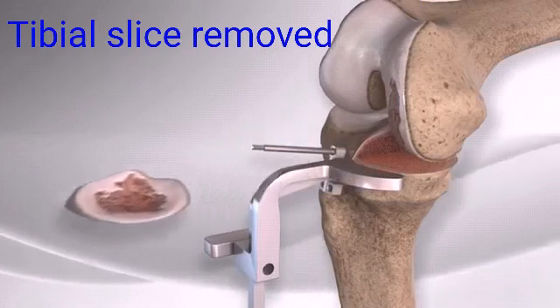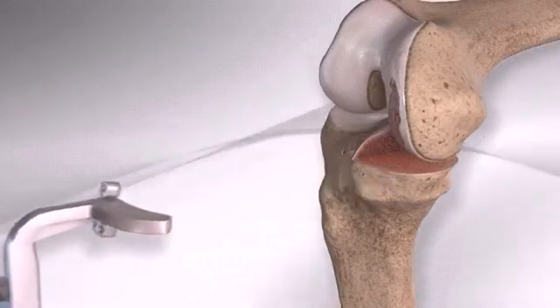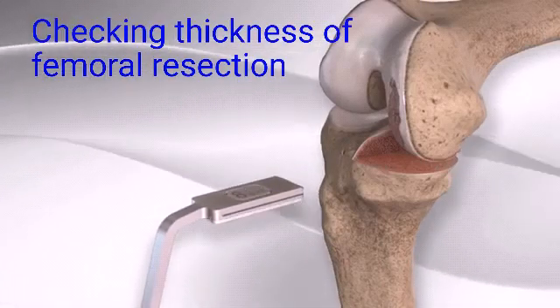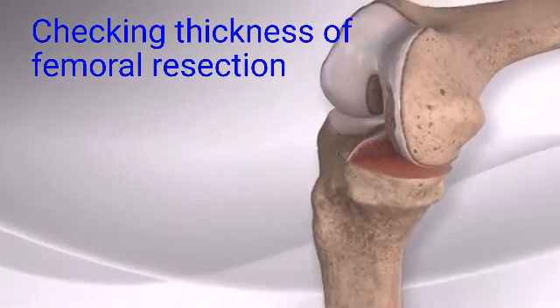After removal of only the diseased portion of the tibia, the guide is removed, and an innovative knee space measuring system is employed to make sure a minimal amount of bone is resected on the femur to allow for matching of the correct size implants.